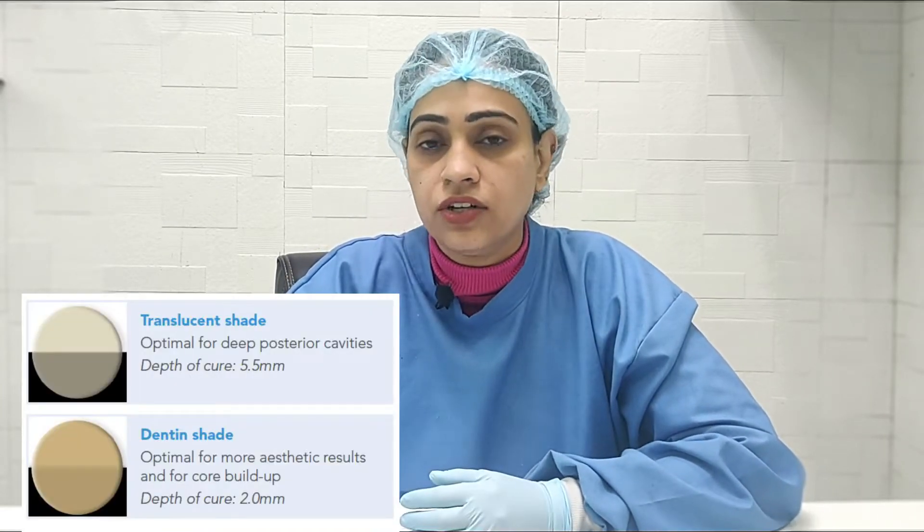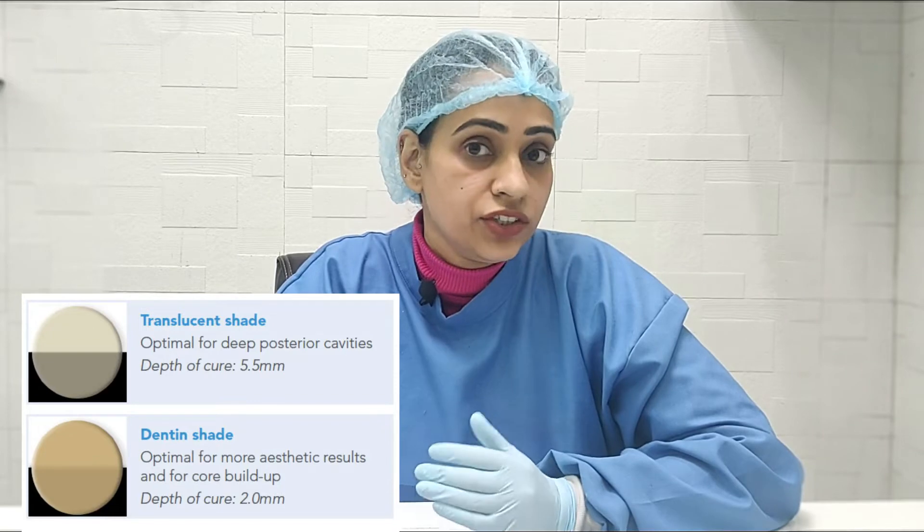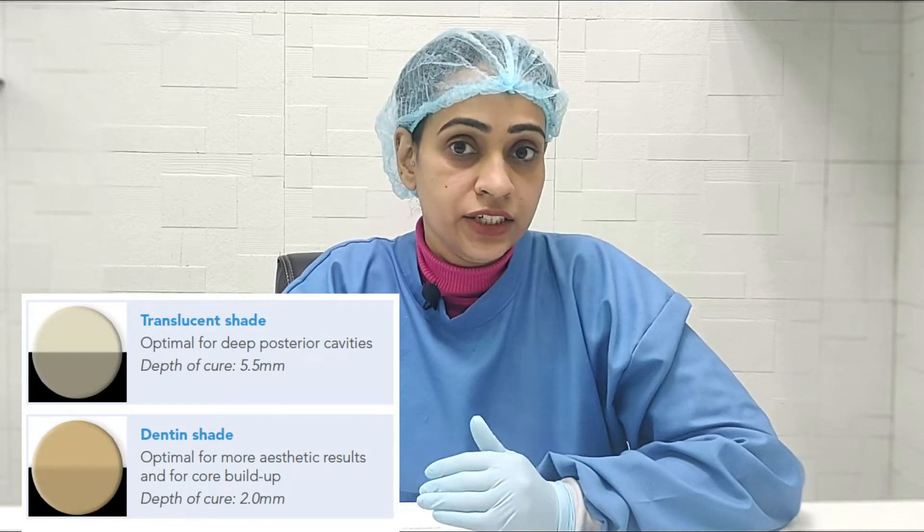Since it's a fiber-reinforced composite material, the polishability is not that great and only two shades are available. So we really need to top it up with a conventional composite — that can be an enamel composite. The reason I use it in pre-endo buildups and large cavities is because it has very controlled flow, absolutely no slumping, and the fracture resistance is excellent.